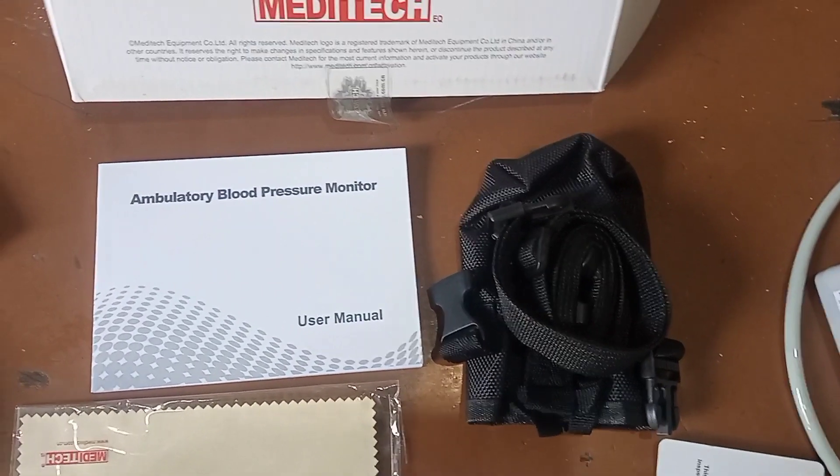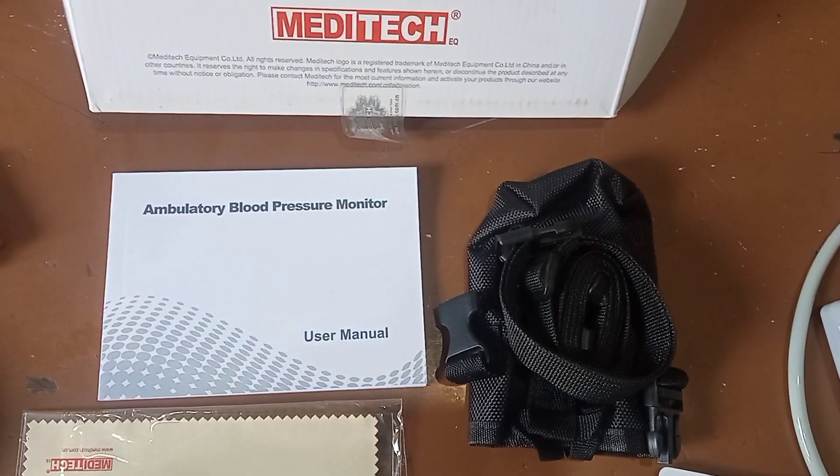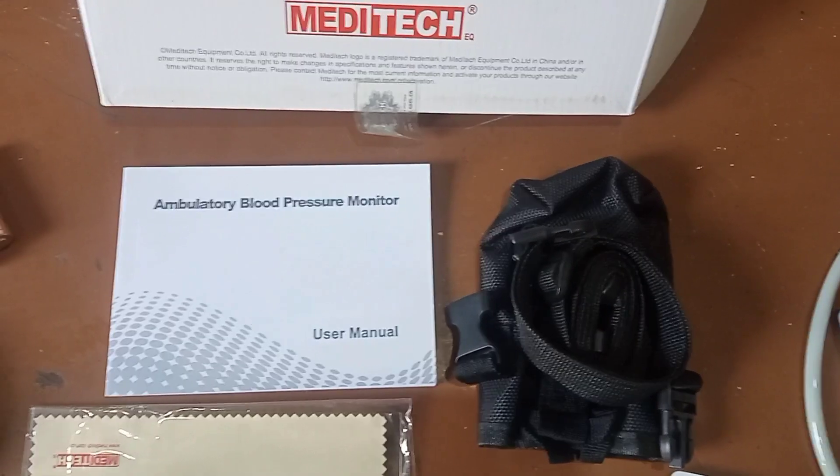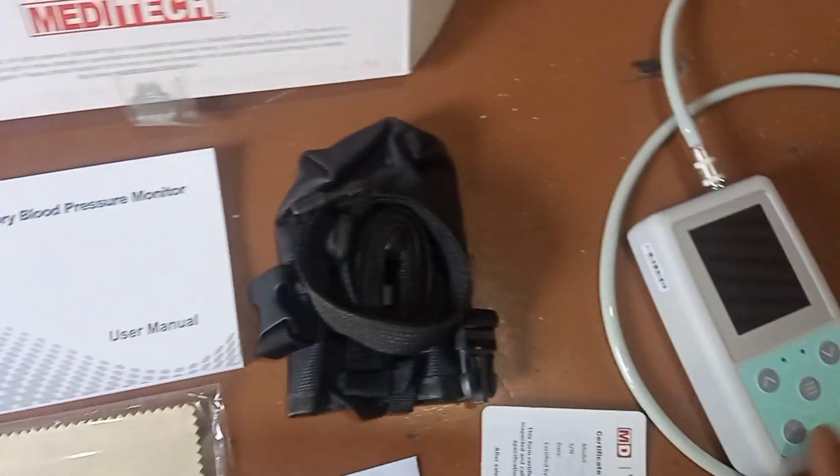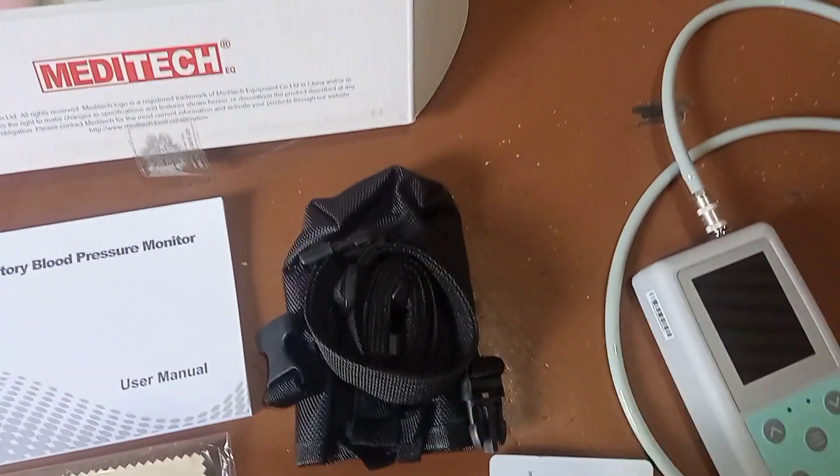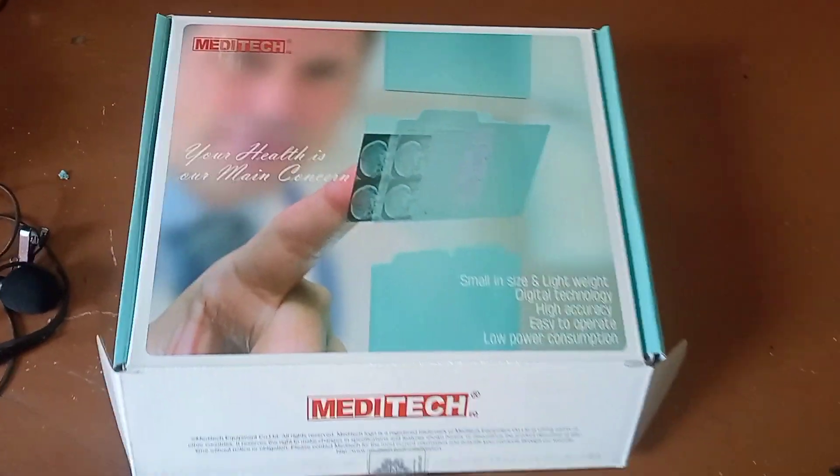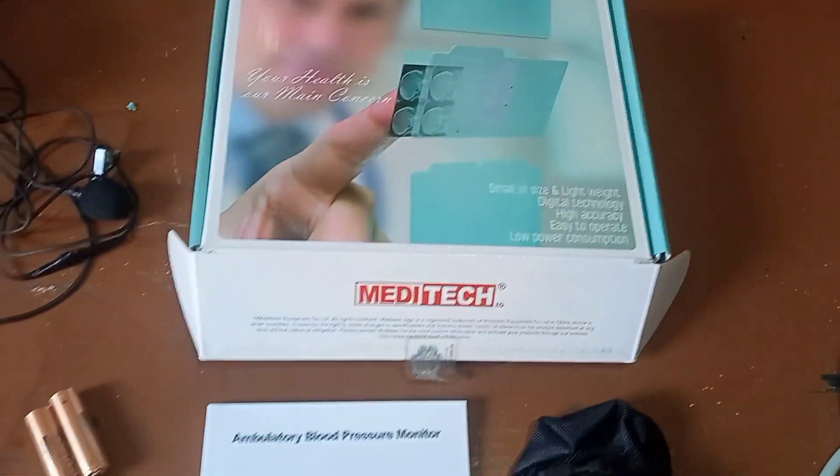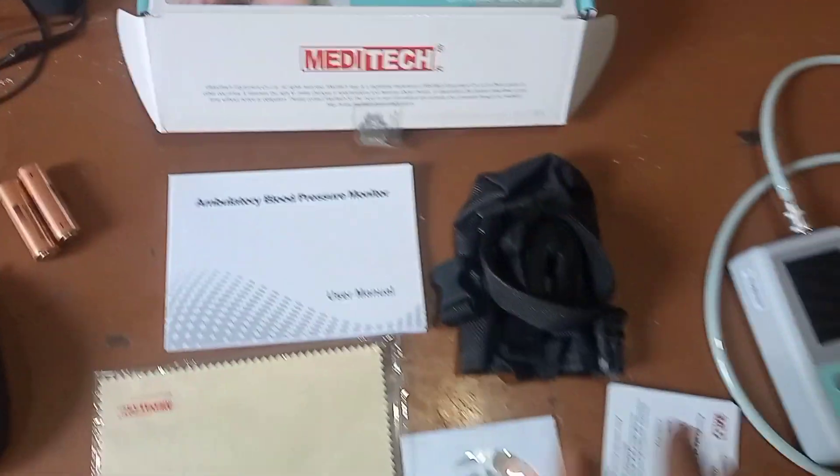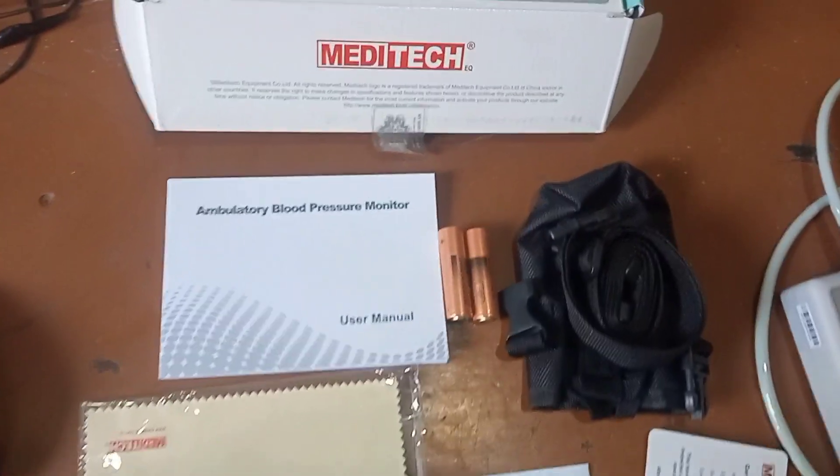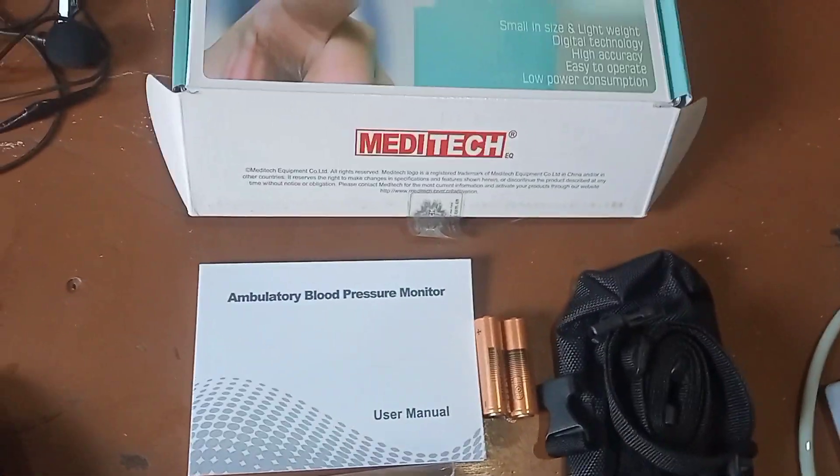This is the bag where we put the ABPM machine inside. This is the box in which the machine and all the systems come, including inside this, and this is the cell in which the battery is used for the system.